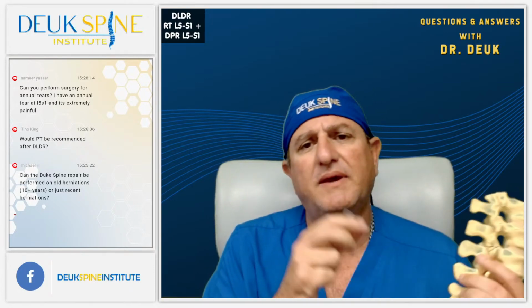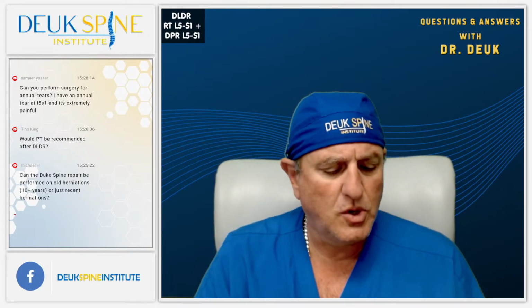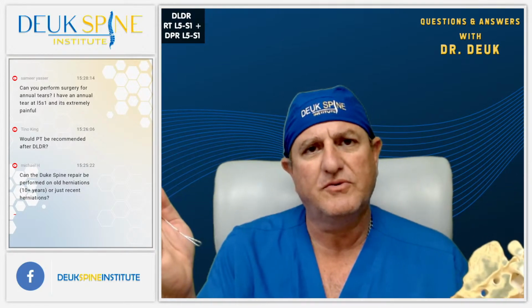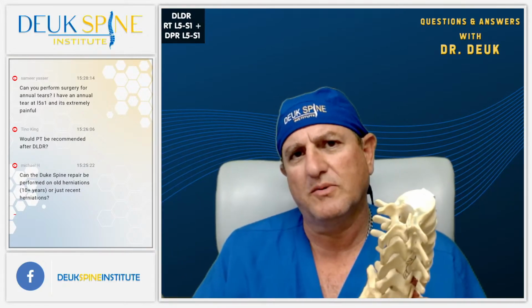Your disc is causing pain, also the facet joint. So you need to have both of them fixed. And some people ask me, what's the difference between a radiofrequency ablation and the Deuk plasma rhizotomy?